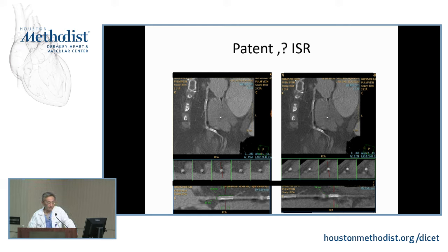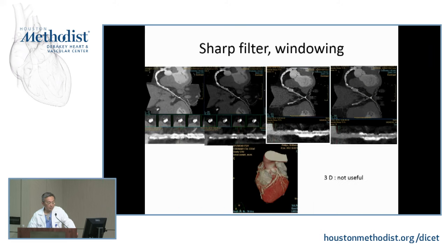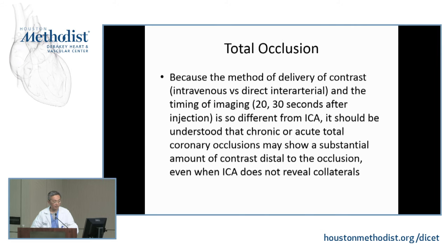And this will be another area of study where PET or perfusion imaging will probably be more useful. So again, similar from a reading and interpretation standpoint, similar concept. You use a sharp filter, windowing, and remember, for very calcified lesions and stents, 3D imaging is not useful at all.